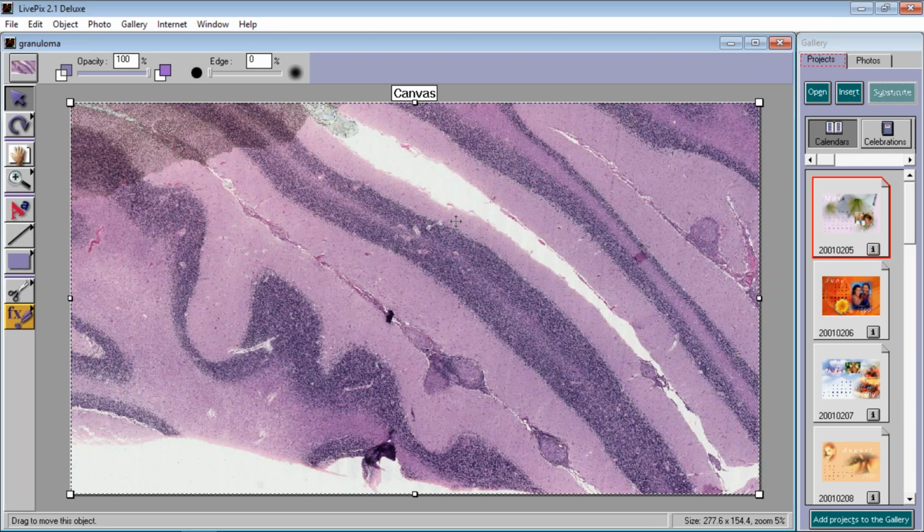And you can also say, rather than these things being called gyri, they're called folia now. So you go, okay, so it's a normal cerebellum. Let's move on. But wait a minute. Take a look at this space here where the meninges are between the folia. You got a lump of stuff there. You got a lump of something there. You got a lump of something here. You say, wait a minute, that can't be an artifact. Let's zoom in on that and let's see what it is.